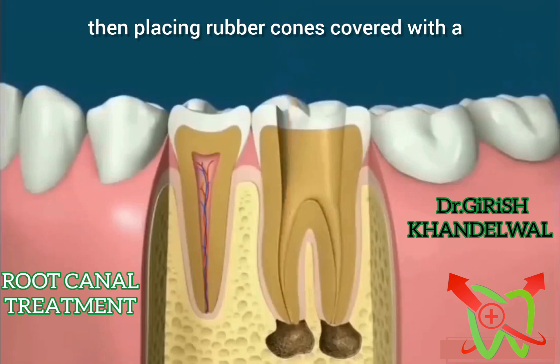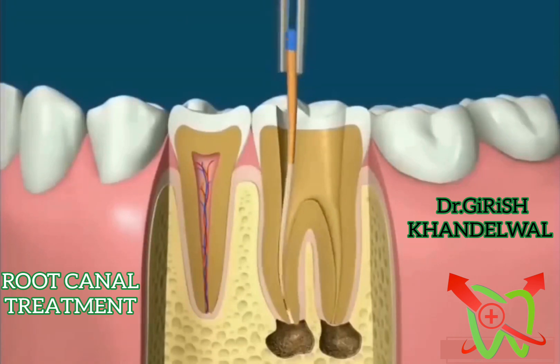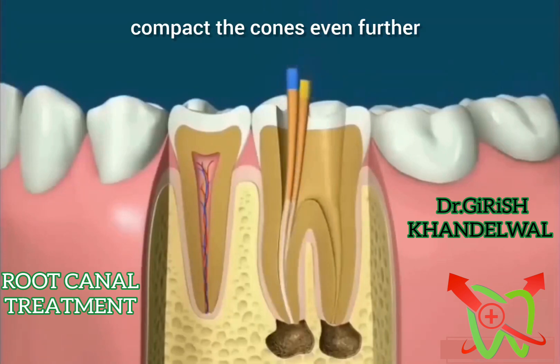Rubber cones covered with a liquid sealer are placed into the canals. Once enough cones have been placed, spreading instruments can then be used to compact the cones even further.